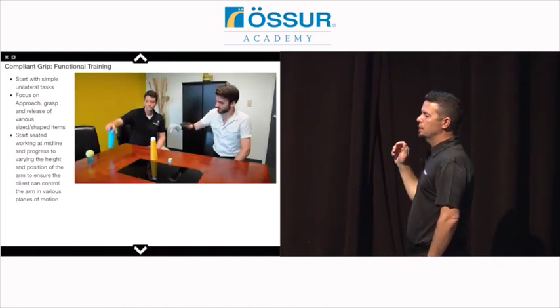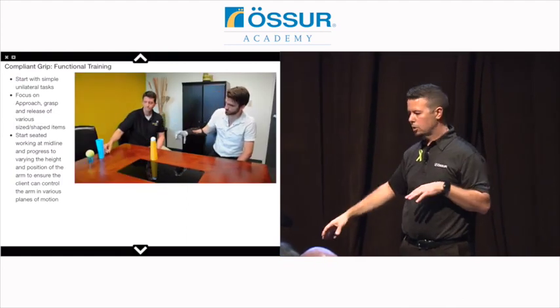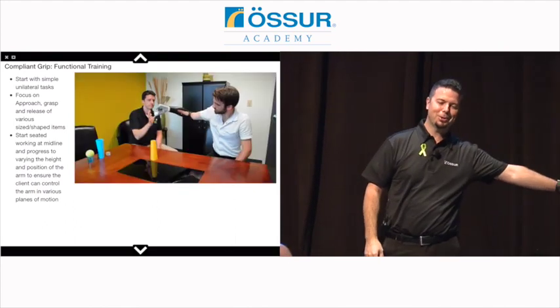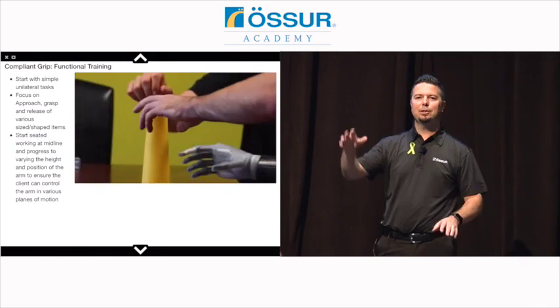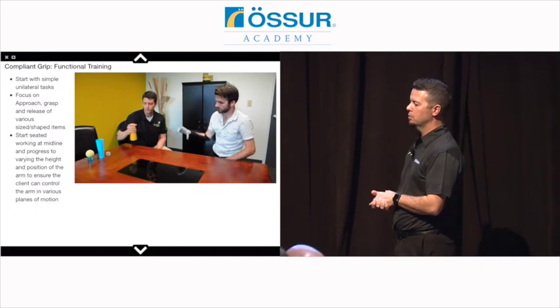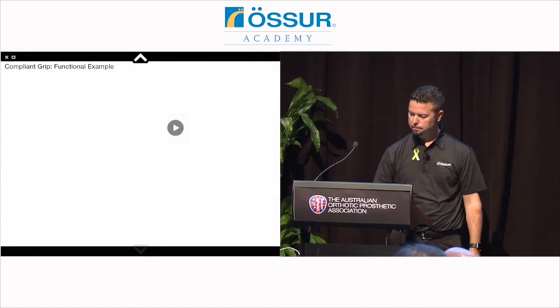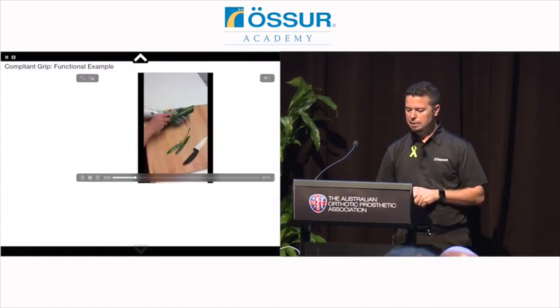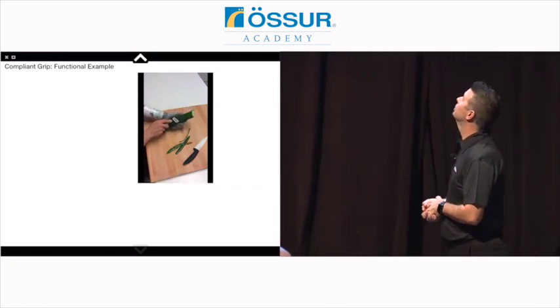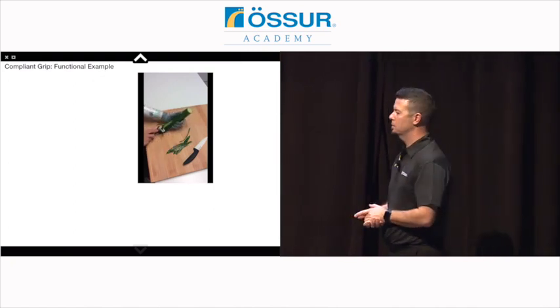And what you're looking for here is that life doesn't exist just in this little bubble in front of us. We're constantly reaching. Maybe you're in the car reaching for something on the passenger seat, or you're in the kitchen working in cabinets, high and low. We need to make sure that the prosthesis is functional in all those different positions. So that's a task to take the user through those positions. And then a functional example, I don't know that I'd jump right to peeling a cucumber with a sharp object on a new hand, but it shows you an example of that compliant grip conforming to the shape of the object that she's holding.